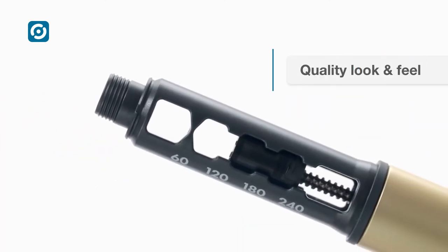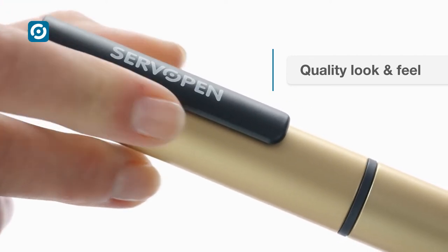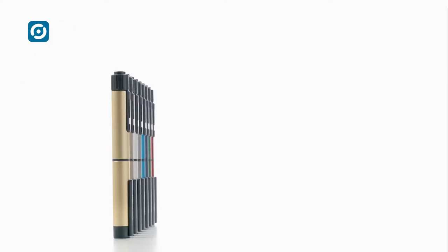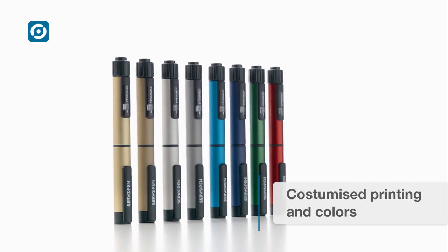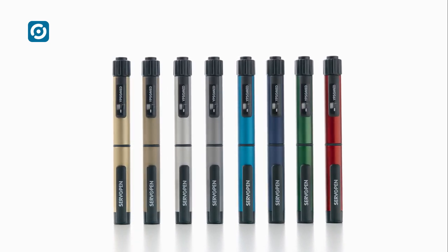ServoPen has a quality look and feel thanks to its metallic housing and pen cap, providing a guaranteed pen-in-use lifetime of up to three years. The colours of the housing and pen cap are customisable. Printing on the pen cap, dose scale and cartridge holder are selected according to customer and therapy needs.